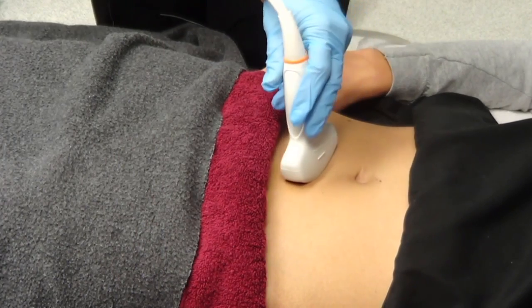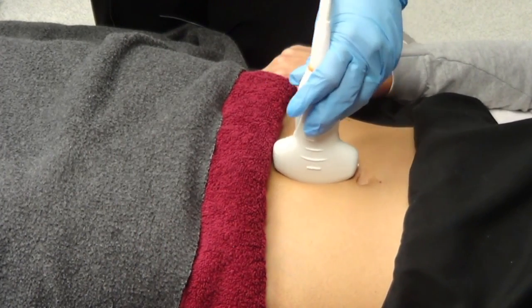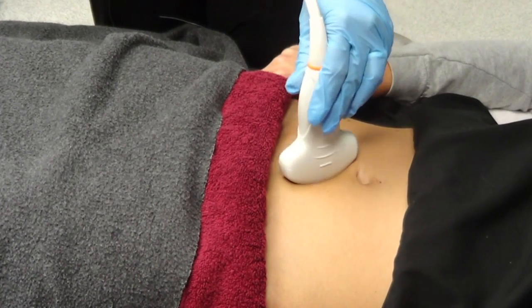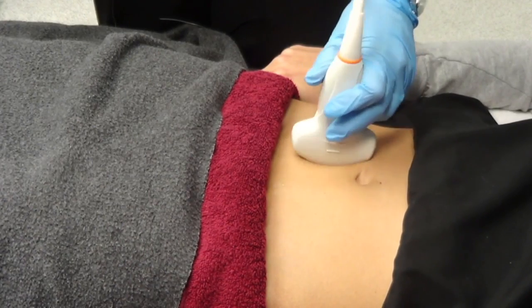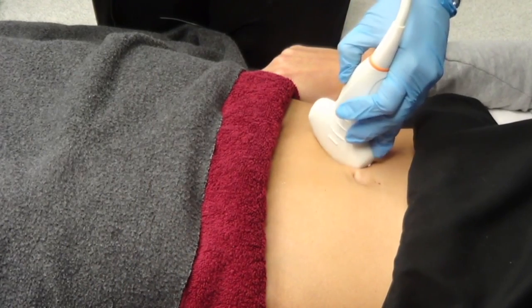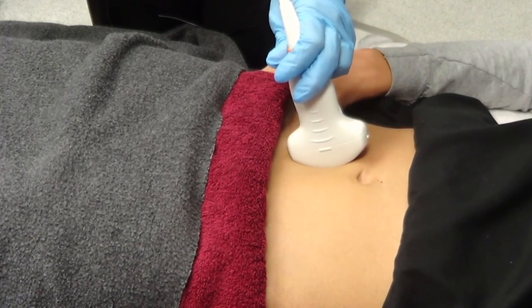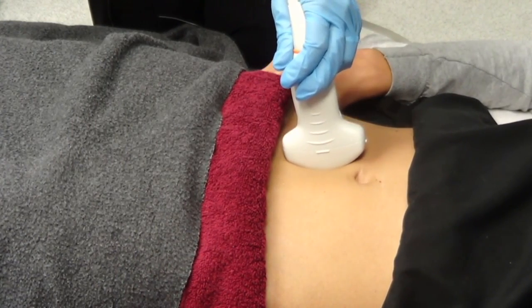Okay? The probe movements, if you recall, are going to be our heel-toe, our sweep or fan, our pivot or rotate, and by pivot and/or rotate, you can also anchor the toe and move the heel, or anchor the heel and move the toe in order to align.